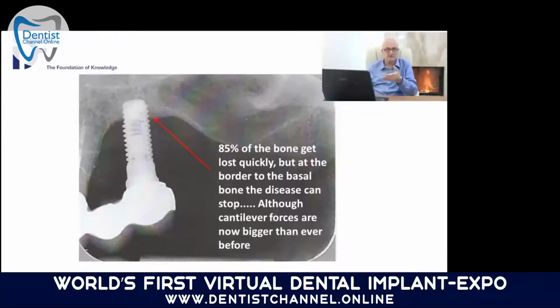Now, this situation is stable. So this idea of these collar forces, this FEM analysis showing big explorations from the universities, they show that this is all true, but of course it's not true, because the examples of these cases show us that the less bone there is left around an implant, the more durable and stable the situation is. Now, why is this so?